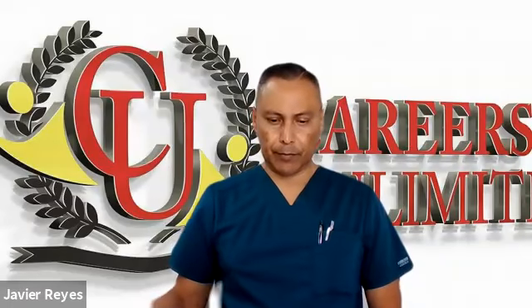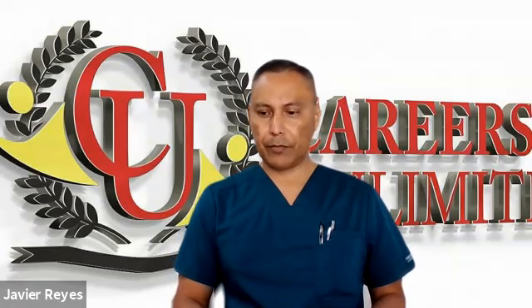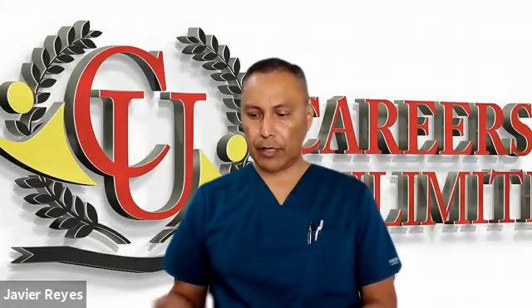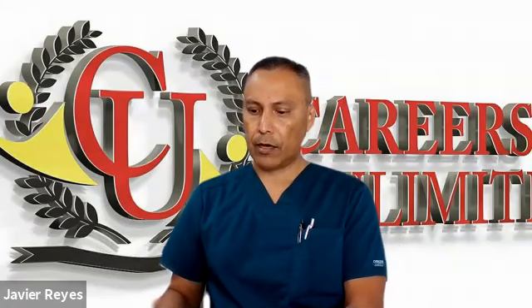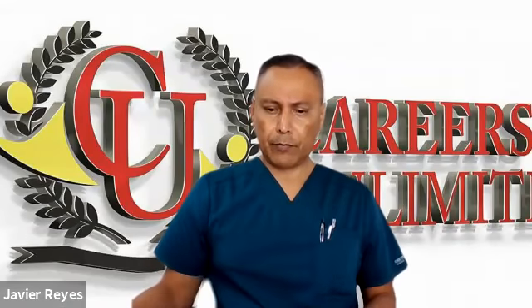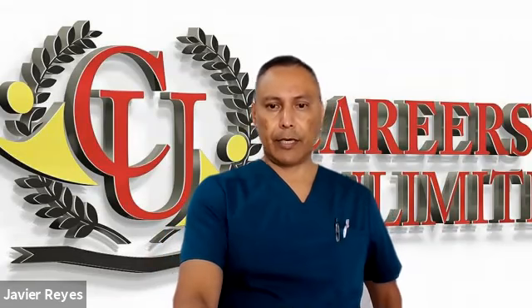So continue with your practice on rhythm identification so that you can master these two. These are very simple. There are only two arrhythmias. After this, we're going to continue with pacemaker rhythms, which are also very easy to spot. I believe it's also a short chapter. When you see them on the EKG, they're very noticeable. So for right now, you're done with bundle branch blocks. Make sure you complete those rhythms, that practice, so you can master these. And we'll see you on the next chapter, 11.